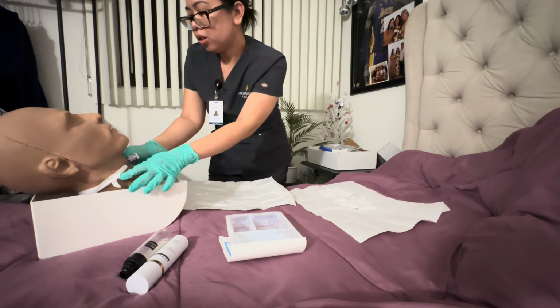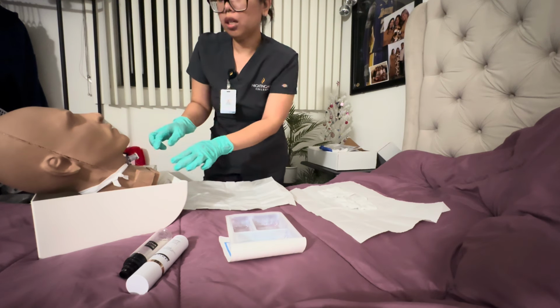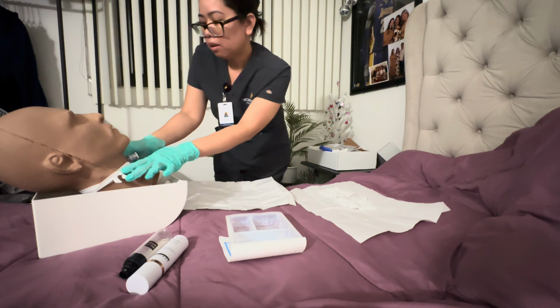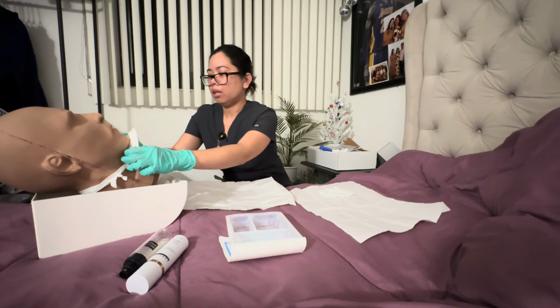Okay, so once it's tied, just make sure that it is not too tight. It's tight enough, but you can still put about 2 finger widths inside. Make sure it's snug but not too tight. Okay, now that's done, we're gonna be putting the gauze around this area.